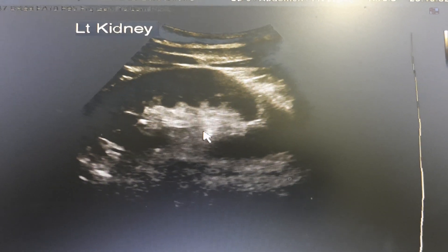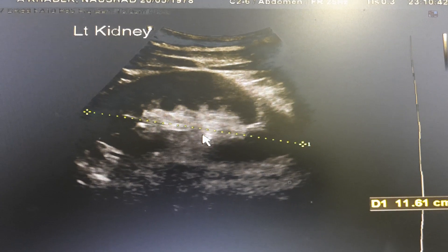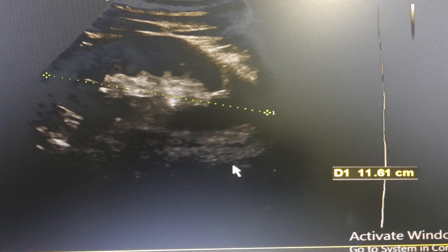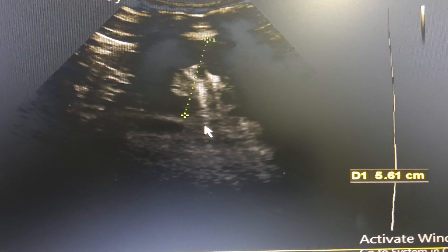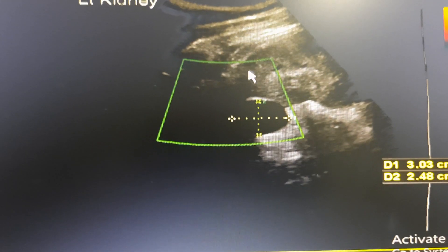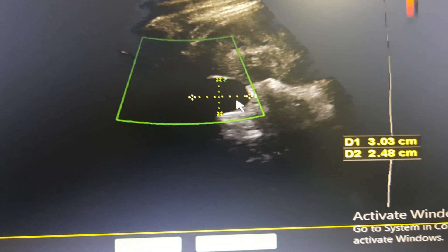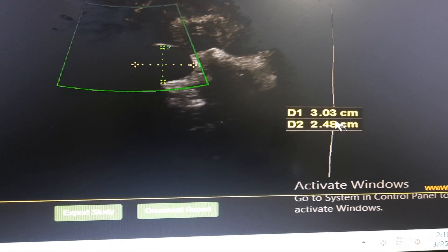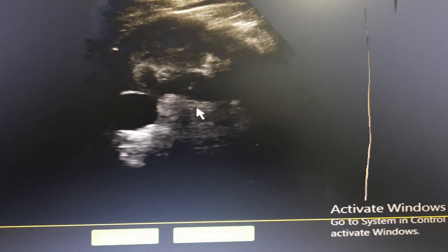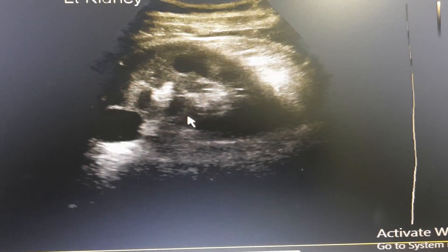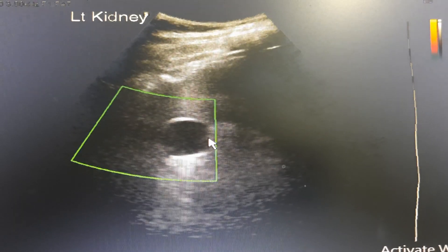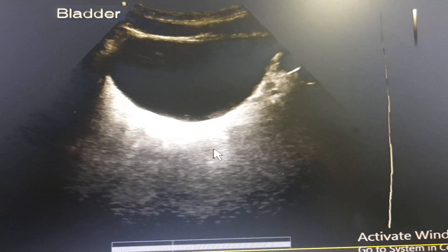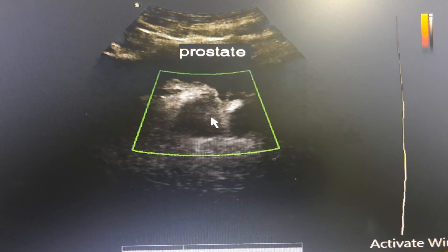This is the left kidney with its corresponding measurement. The left kidney has a cyst — a simple cyst — with its measurement. This is the left kidney. The bladder is very nice. And the prostate.